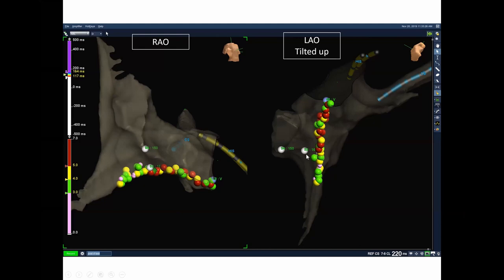And we've actually put in the numbers here, so these white dots are where we've gone and checked for CTI line block at the end of the procedure. Unfortunately, the 160-something number is hidden underneath this ablation lesion, but the numbers are longer pacing from here versus pacing from a more lateral point. The CS is over here, which is exactly what you want.